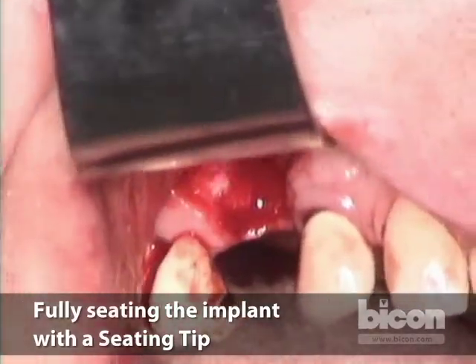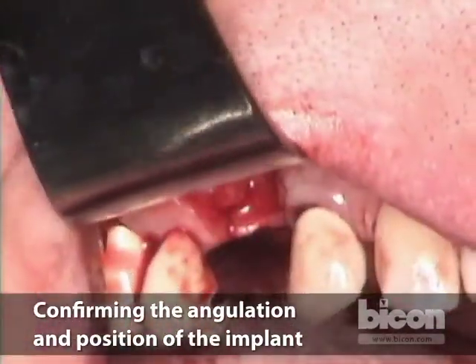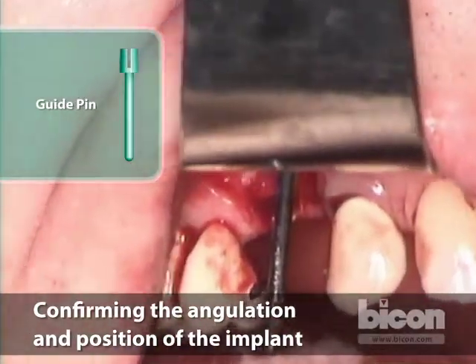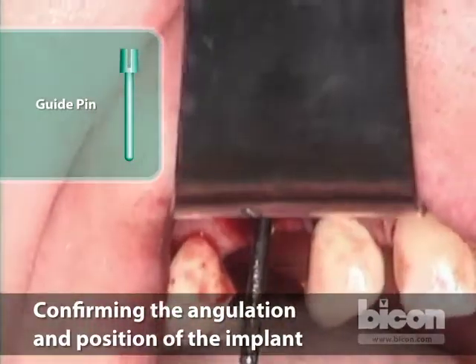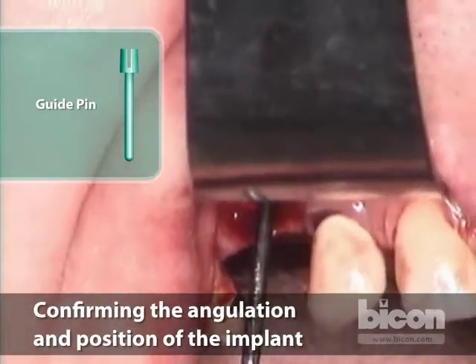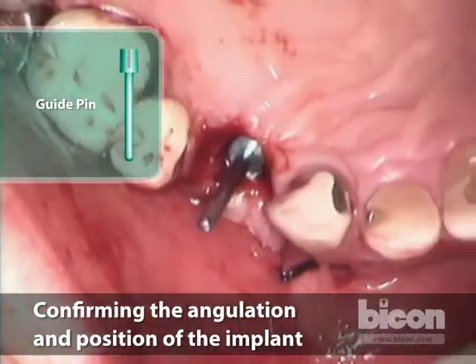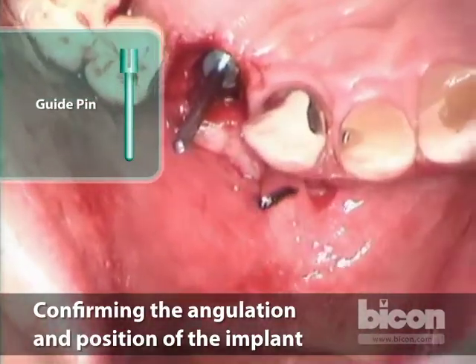That's it. Suction. Before we seal this implant in place, we want to just verify that its location and angulation are what we want them to be, because if you don't like it, this is the chance you have. This is one chance you have at, let me have the mirror please, that mirror, where you can actually take it out and change it with impunity. Okay, so we see that the location, angulation are acceptable, workable, actually pretty good.